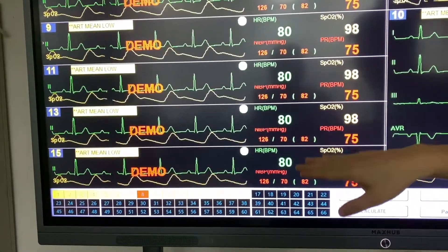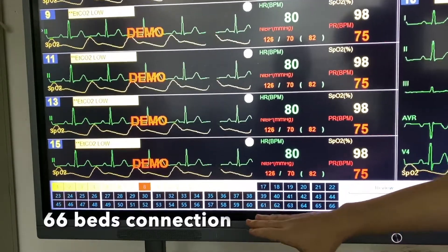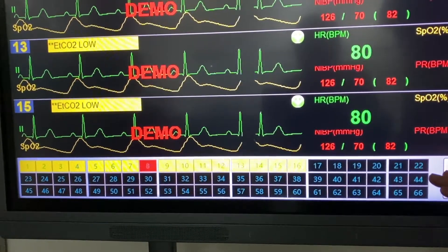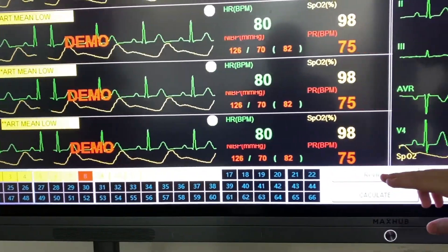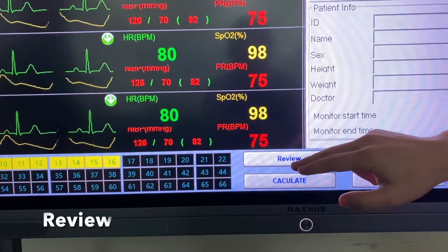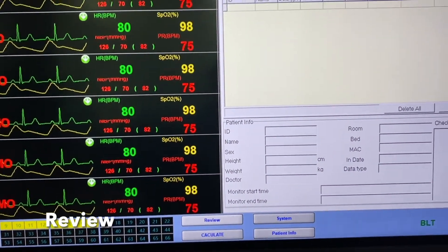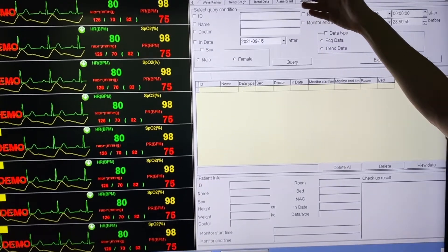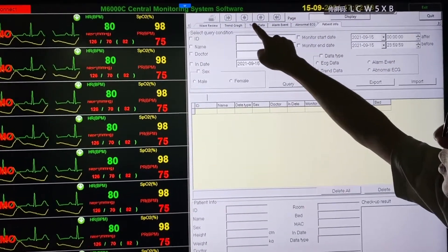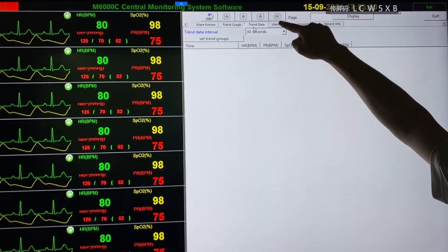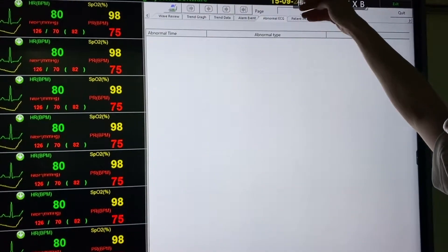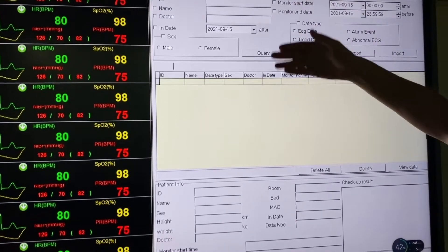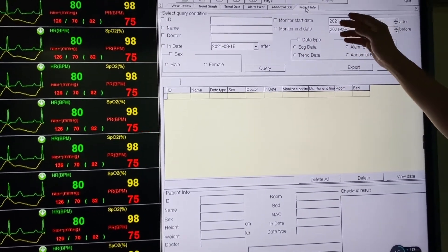When we set up the central monitoring system, we'll be able to connect all 66 monitors into the CMS. We also have a review function — clicking on it brings us to the review page where we can review patient waveform trends, graph trend data, alarm events, abnormal ECG, and patient information. We can also edit the patient's information.